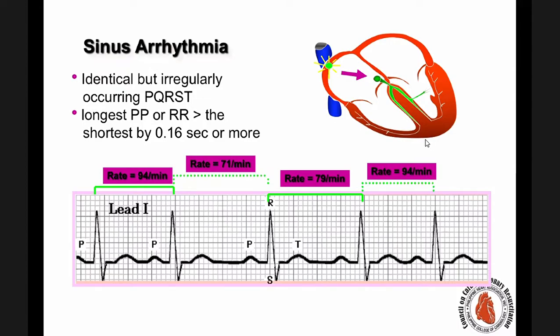And when you exhale deep, there is increased parasympathetic activity, and that's why there is slowing of the heart rate. And so pag nag-ECG ka ng isang pasyenteng tachypneic, the ECG will appear as there is normal sinus rhythm and sometimes between 60 to 100, for example, pero nag-iiba-iba siya. So that's sinus arrhythmia. You will read that as normal sinus rhythm with sinus arrhythmia. Did you get that? So there's still PQRS in every beat, but the R to R interval is visually irregular.